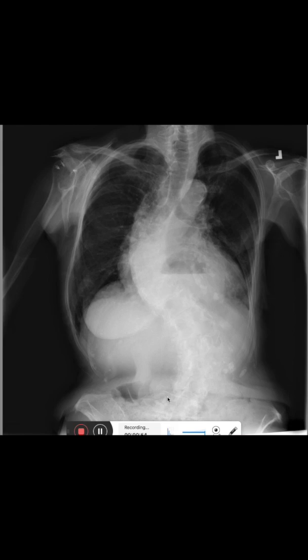What we can also see is that the thoracic aorta is elongated, that's why it has this kind of bump here on the side. And also it has sclerosis here in the aortic knuckle.